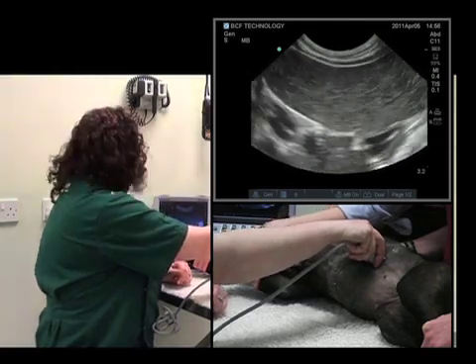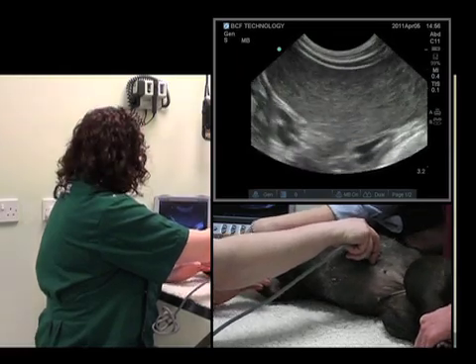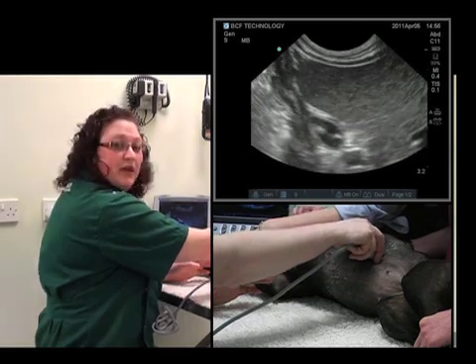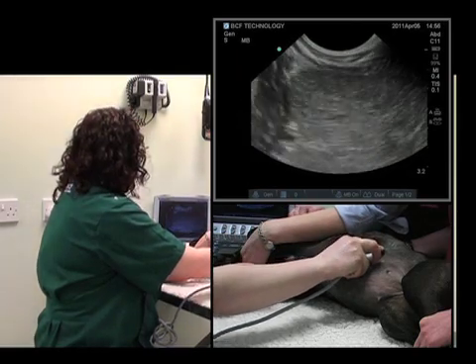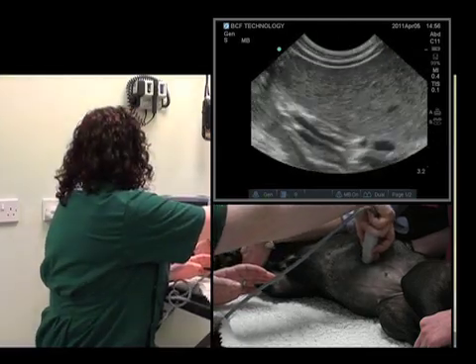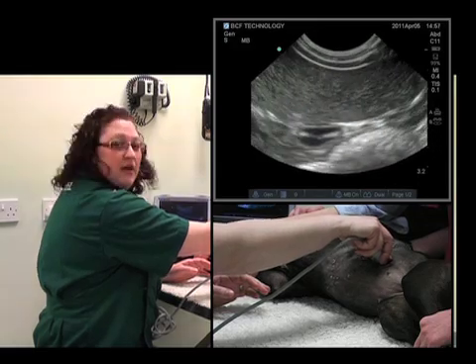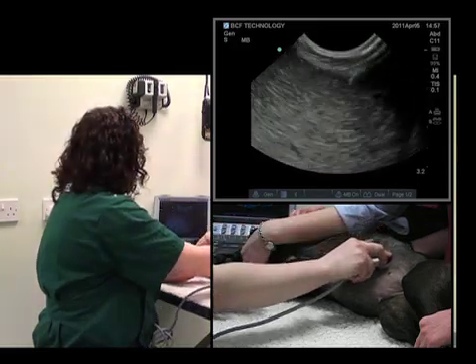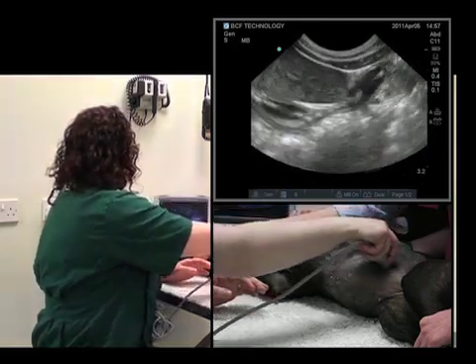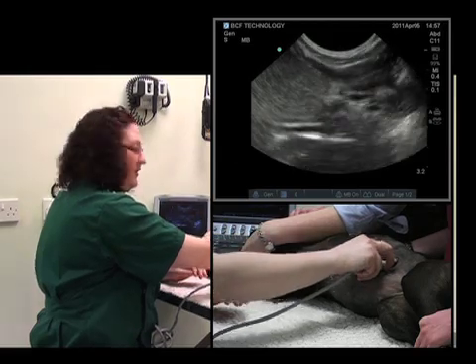What we can now do is start to examine the spleen in a methodical manner. We'll start at the cranial border of the spleen and fan up and down. Then slide caudally and fan up and down. Now we're at the tail — fan up and down.